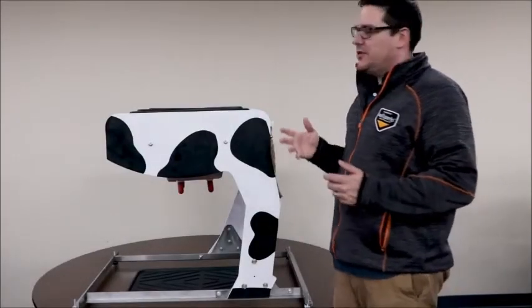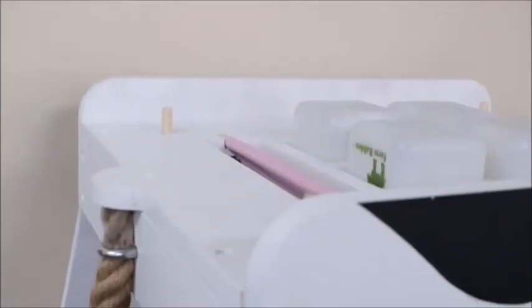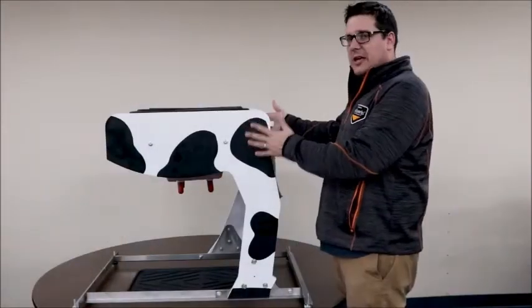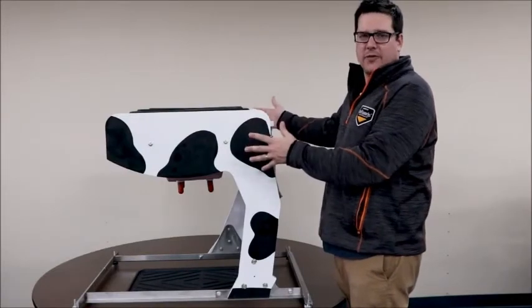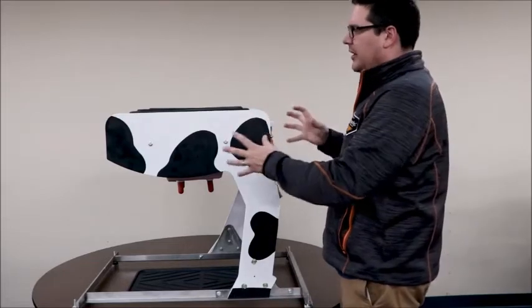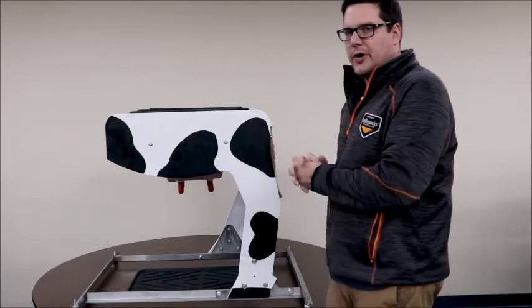RealityWorks is excited to introduce the bovine milking udder simulator. The focus is getting students to understand the udder and how it works. It has about the same height and width as an average cow, so students can get a feeling of what the width is and where the legs are compared to the udder.